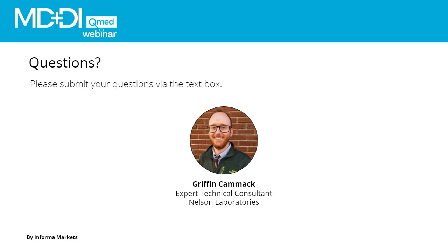So there's not really one magical neutralizer for everything. We wish there was, here at Nelson Labs, because that would make it very easy. But there are different neutralizers, and it really just comes down to what your disinfectant is. And that's something that I can answer offline and give a little bit more information about some of those common active ingredients.